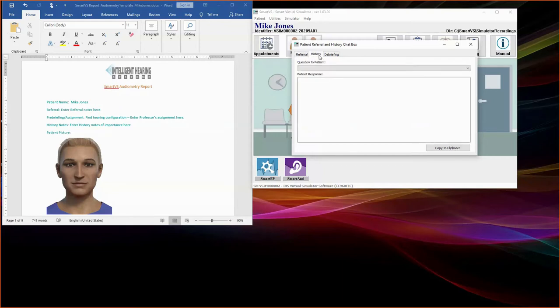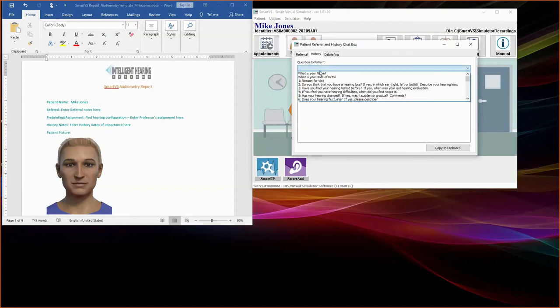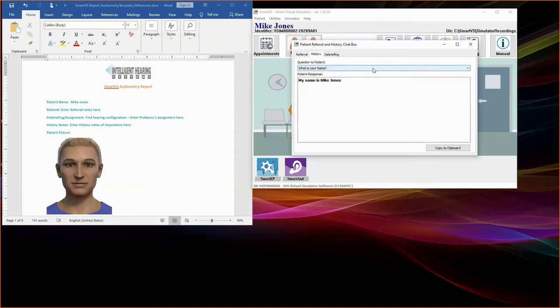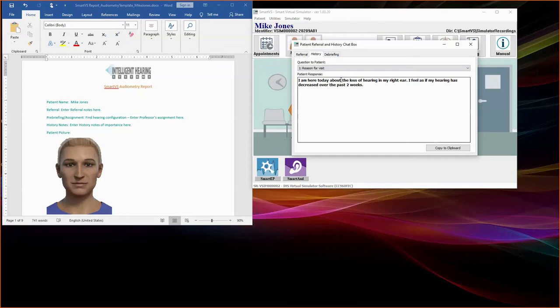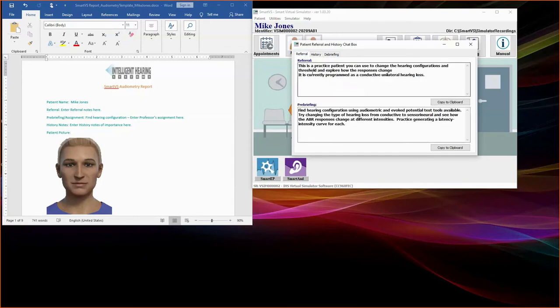Next, select History. Here you will see a list of questions pertaining to your patient. You may copy and paste any important history notes or any of the referral or pre-briefing information into your patient report, either using a copy-paste function or using the copy-to-clipboard option. Once you have reviewed the referral and history information, you may exit this box.